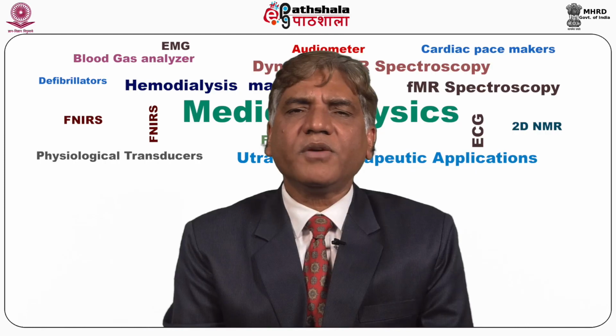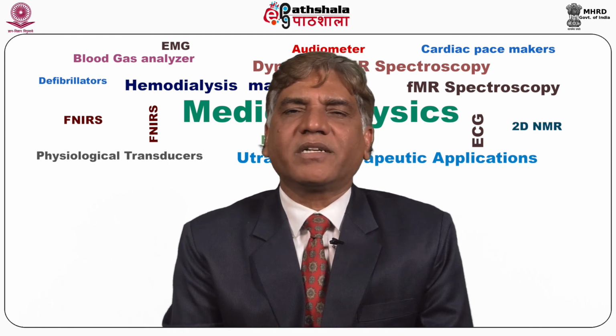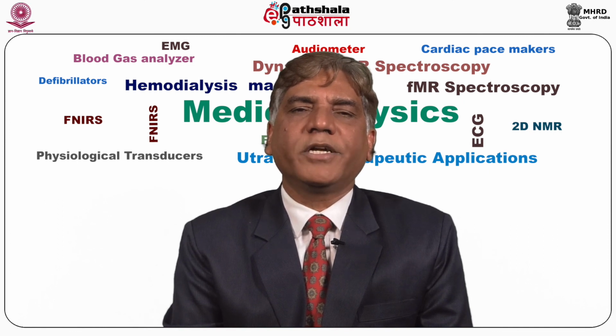Shim coils. Shim coils interact with the main magnetic field to improve the magnetic field homogeneity over the volume of interest used for patient imaging. The process of making the magnetic field homogeneous is known as shimming. It can be achieved by metal discs or plates. We call it passive shimming, and with solenoids it is called active shimming, to make the main magnetic field more homogeneous.